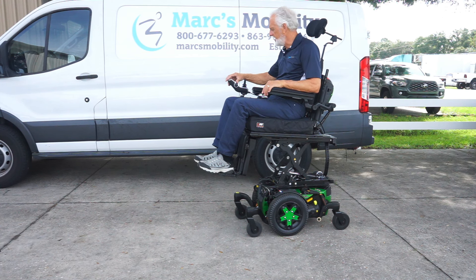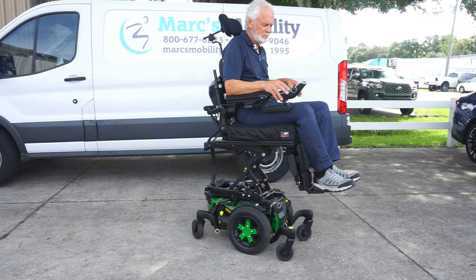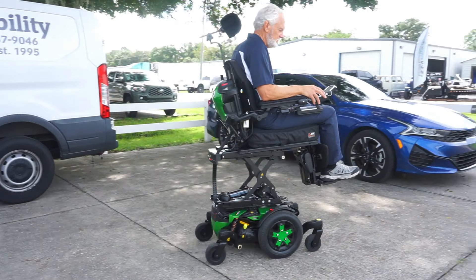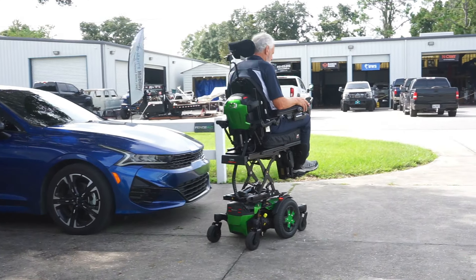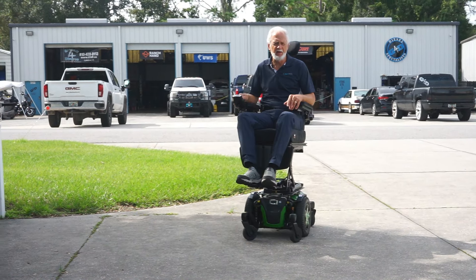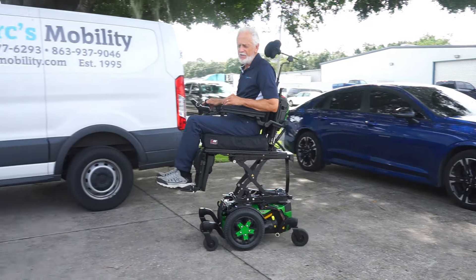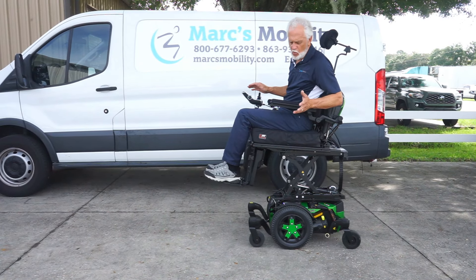The seat is elevated — let's drive it and see how fast it goes. Three and a half miles an hour, which is very fast for a chair with the seat elevated 12 inches. So the top speed on this chair with the seat elevated is three and a half miles an hour, which is a lot faster than walking.